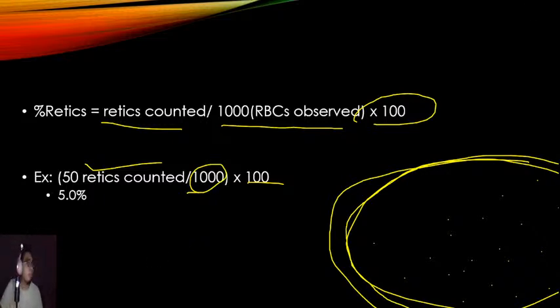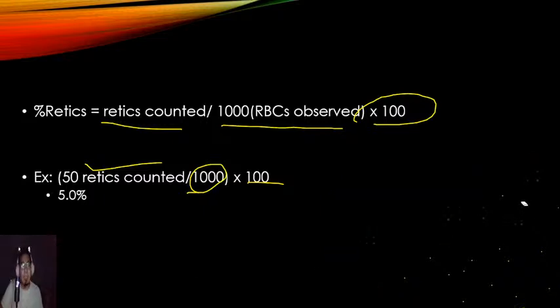Very good. Alright? Ngayon, minsan kapag sinisipag ako, binibilang ko siya isa-isa. Pero, isang field lang yung bibilangin ko. Bakit? Kasi, yung first field na binibilangan ko, doon ako magbe-base ng assumption ko. Na, okay, somewhere around 80 yung cells.